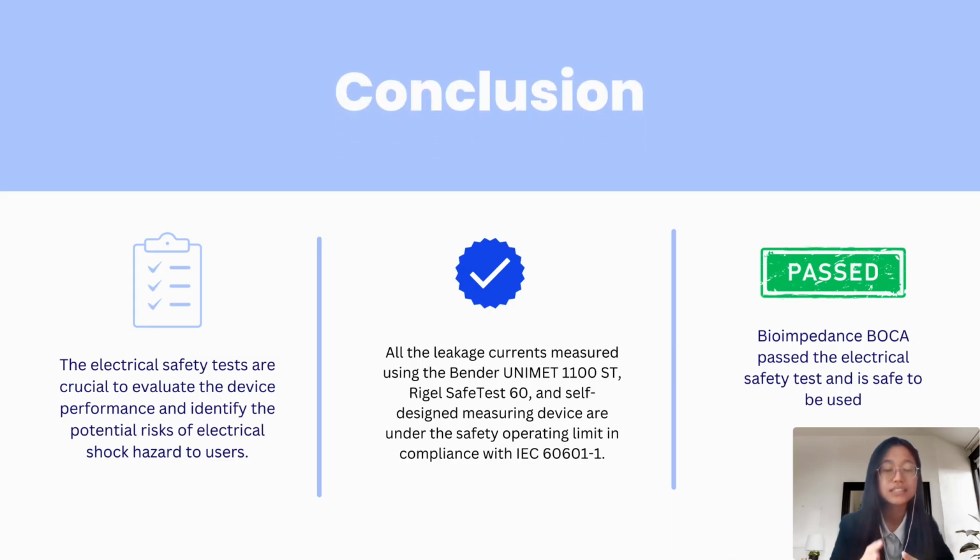In conclusion, the electrical safety tests are crucial to evaluate the device performance and identify the potential risk of electrical shock hazards to the user. Bioimpedance Boca passed the electrical safety test and is safe to be used.